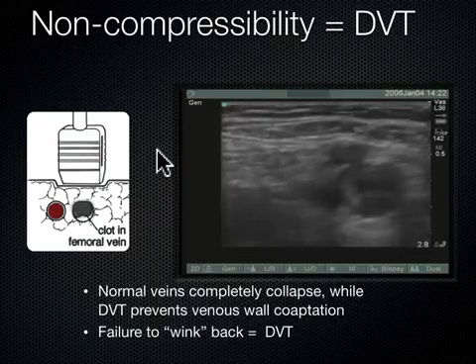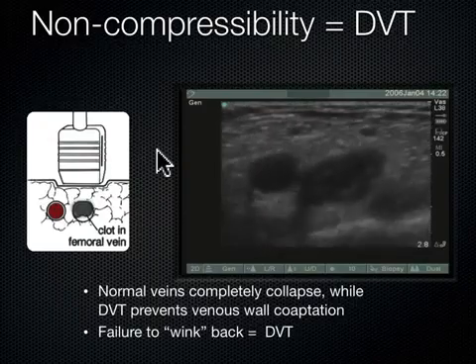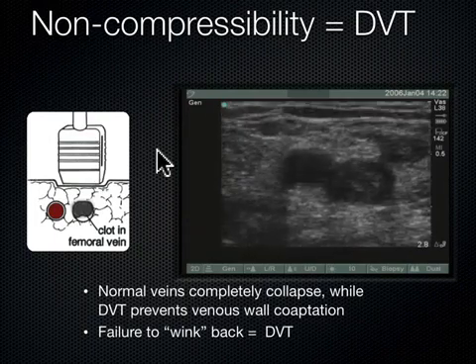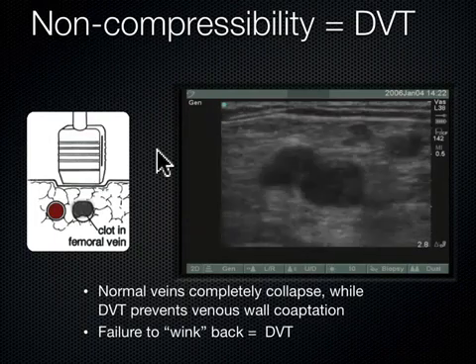So that's why whenever I see one, I get called in the room and everybody's bouncing on this clot. I'm like, whoa, whoa, whoa, stop, everybody, stop. Okay, enough teaching on the patient. Let's go ahead and start treating the patient.